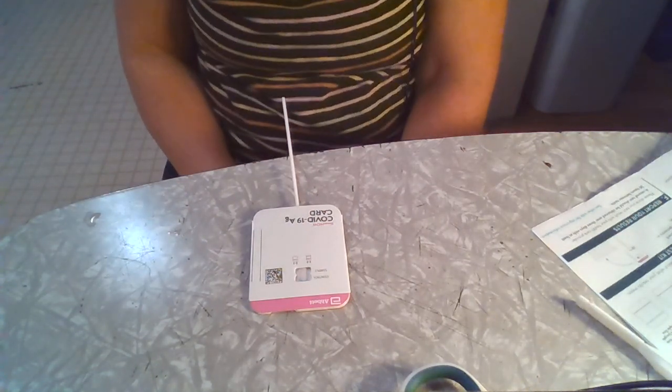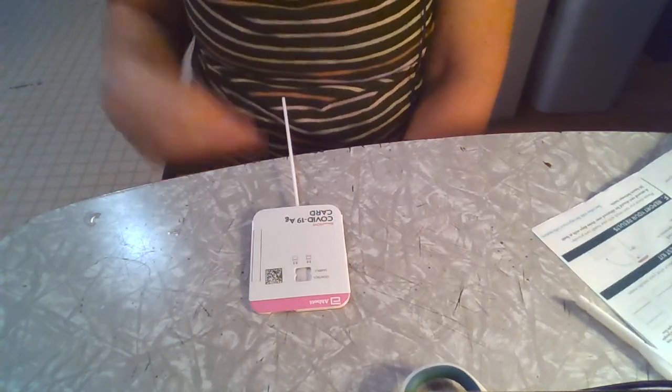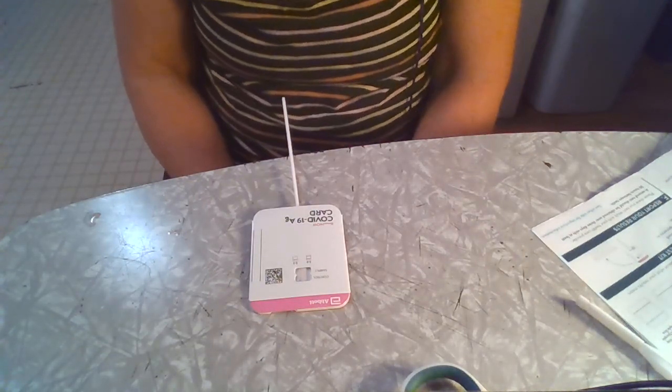Hope you guys can see this okay. And now the blue line is like all the way at the top and going away. So we're going to wait 15 minutes. We'll wait 15 minutes. And I'll just leave it here. And I don't know how to edit, so I'm going to turn this off. And we'll come back after 15 minutes and we'll see the test. Okay.